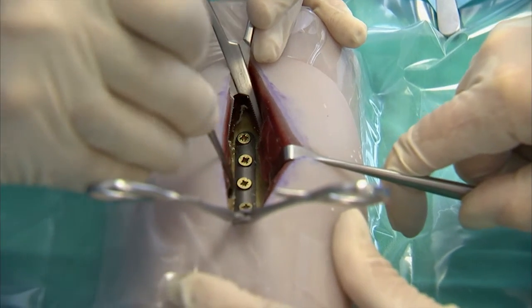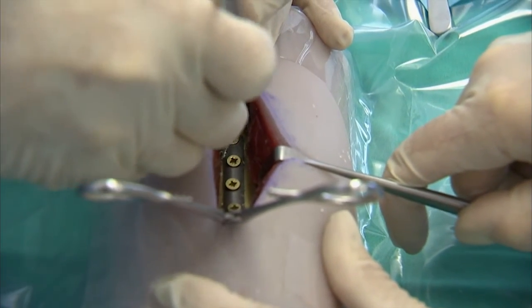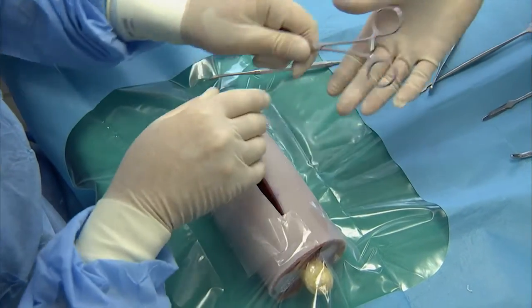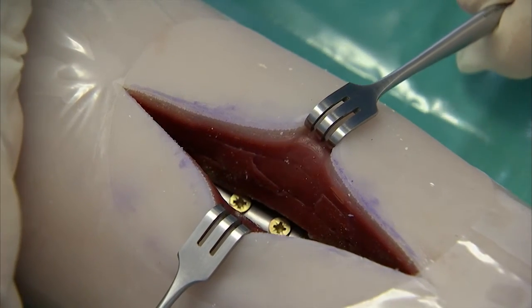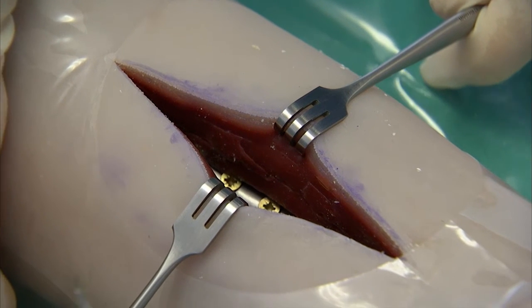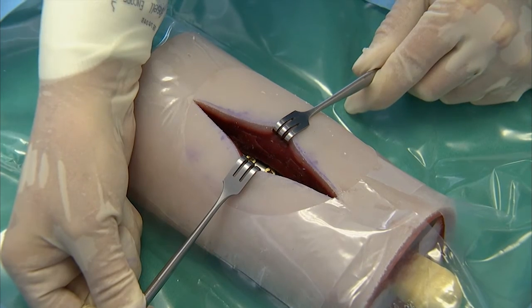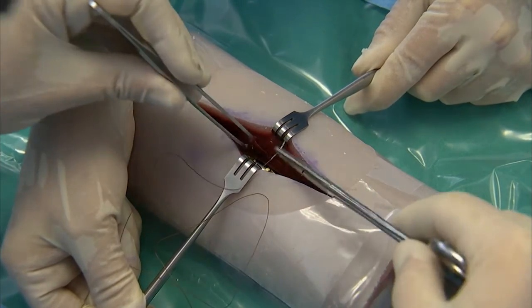Once satisfied with the reduction and fixation, clean the wound and remove all bony fragments. The reduction procedure is now complete, and the operator can now proceed with closing the wound using sutures. Use absorbable sutures to suture the deeper parts of the wound in the various anatomical layers. It is periosteum to periosteum, muscle to muscle, fascia to fascia, and subcutaneous tissue to subcutaneous tissue.